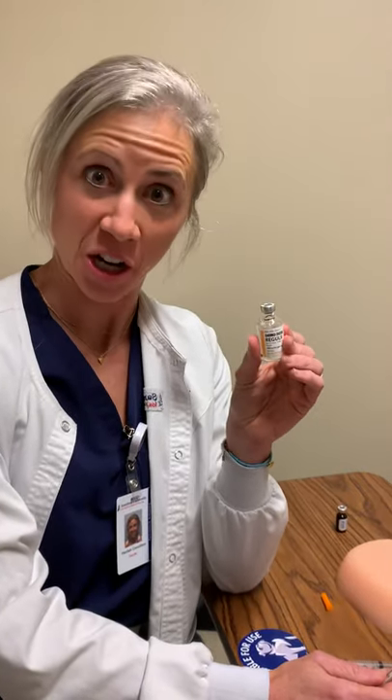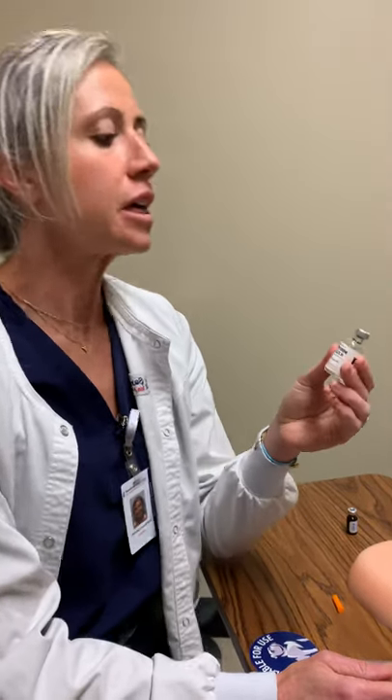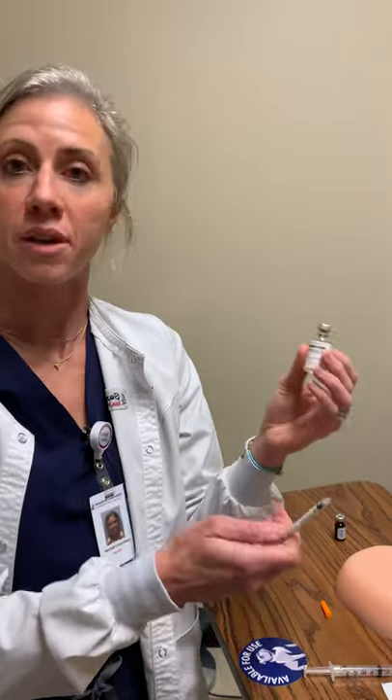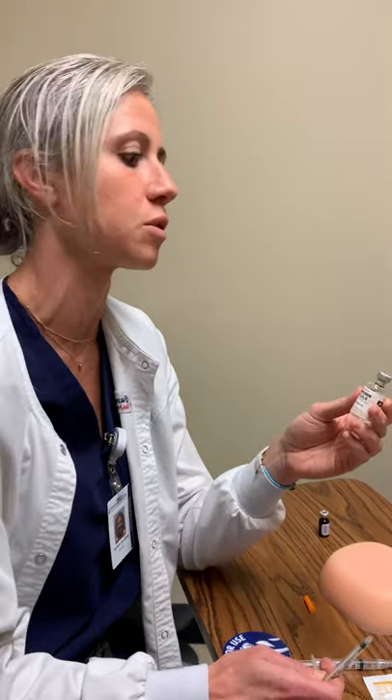This is one of those medications where I want to make sure that I have the right medication. I'm giving regular insulin. The other thing to note — is this a single dose or a multi-vial? This is a multi-vial. So I want to make sure that when I remove the cap, I scrub the hub really, really well, because multiple people are going to be using it. This is not a single dose.